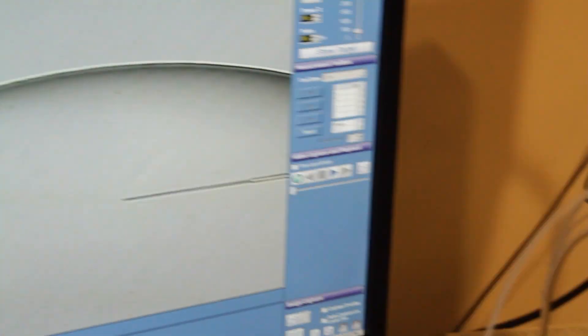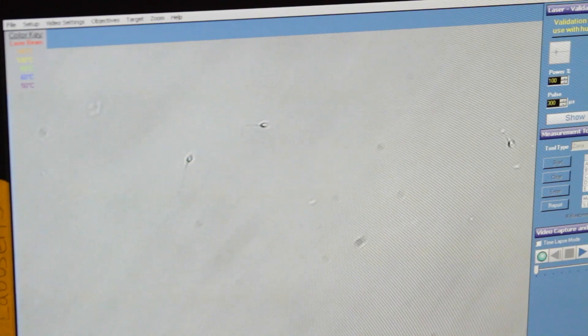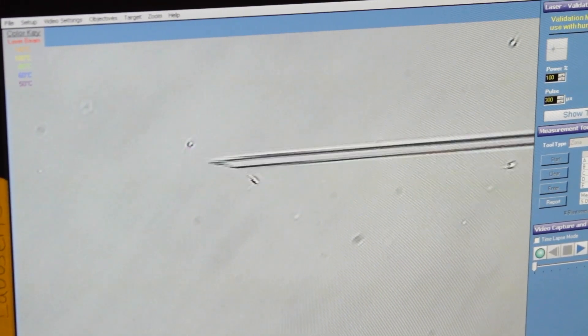The sperm are placed into a viscous solution called polyvinylpyrrolidone, or PVP. That slows them down. It serves two purposes: it slows the sperm down so we can catch them, and it makes it easier to control the fluid because it's viscous, so we're using suction to control the injection.